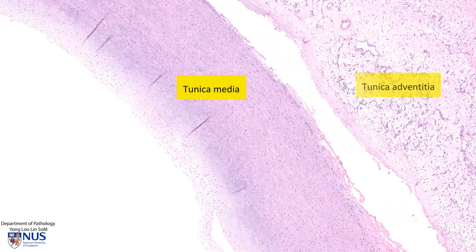Sometimes the layer of the split is a little bit deeper, and we can see that in the same vessel here, the split appears to be between the tunica media and the tunica adventitia.